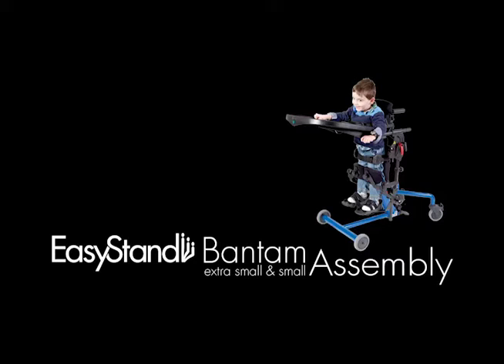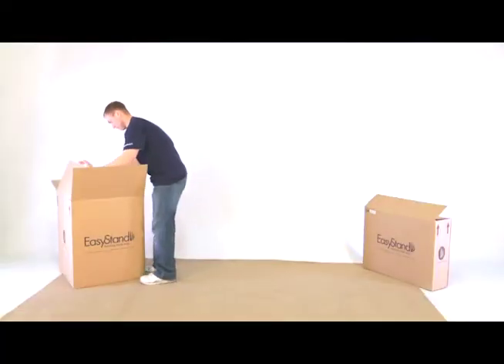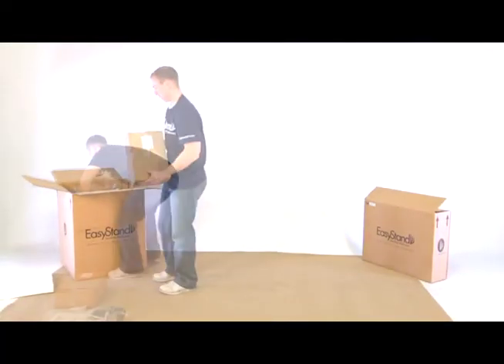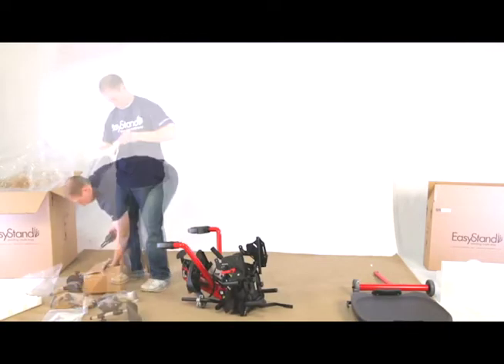This video will show you the basic assembly of the EasyStand Bantam Extra Small or Small. First, we will start by removing all the parts from the 2 boxes you received. Some boxes are left empty for packaging purposes. Remove all plastic wrap from the parts.